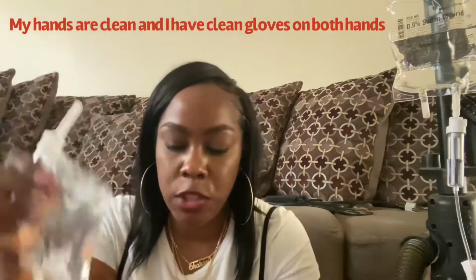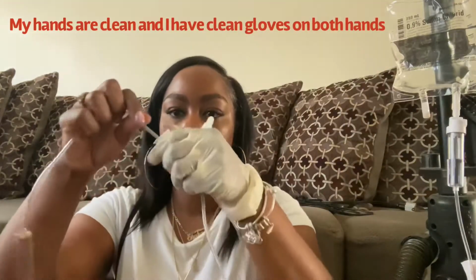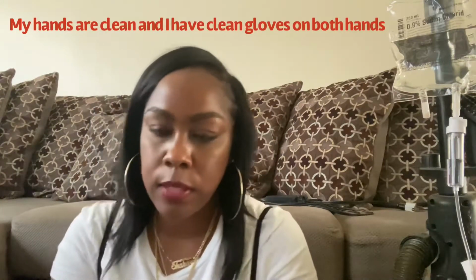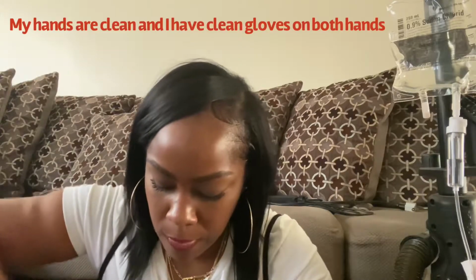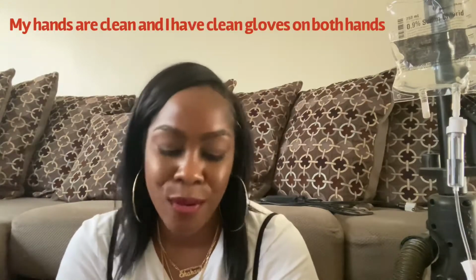I have my medication right here. So what I'm going to do, I'm going to close off this again. Close this off. I'm going to connect this to this again. Remember, I can't touch that. I'm going to connect it. I have such a good patient, so calm, doesn't complain or anything like that.